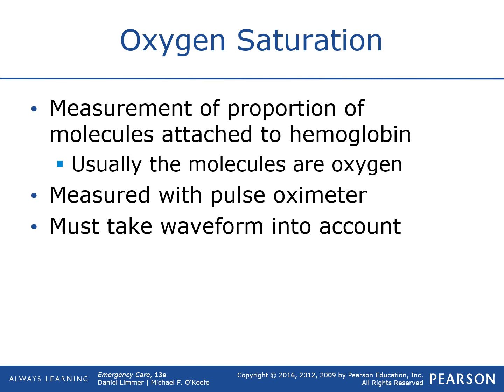So that's why we have to take your oxygen saturation in context, just like the rest of your other vital signs. You need to think of the context going on. If you have someone who is being pulled out of a CO poisoning environment, oxygen saturation is not going to be a very useful tool for you. So that's one of the issues that you can have with oxygen saturation.